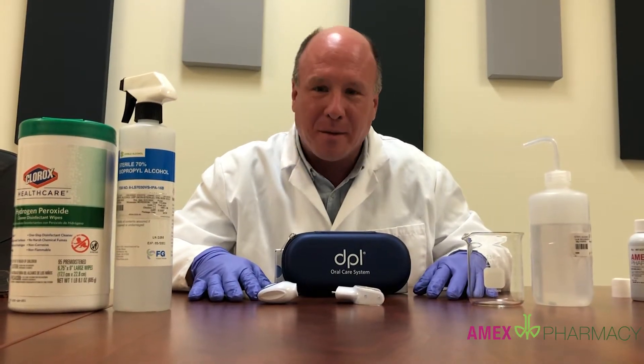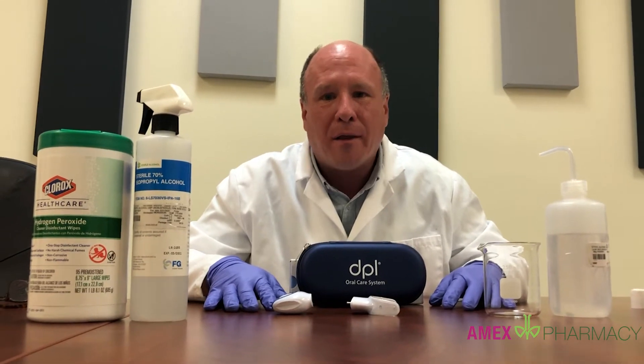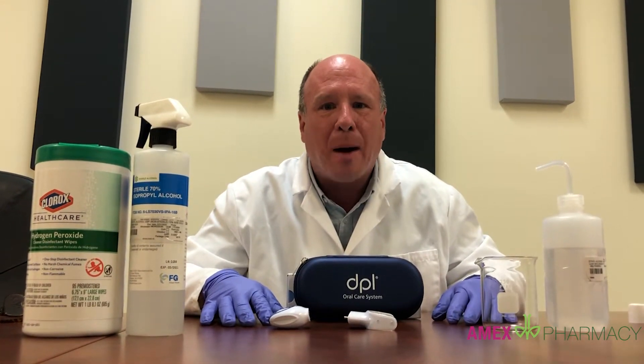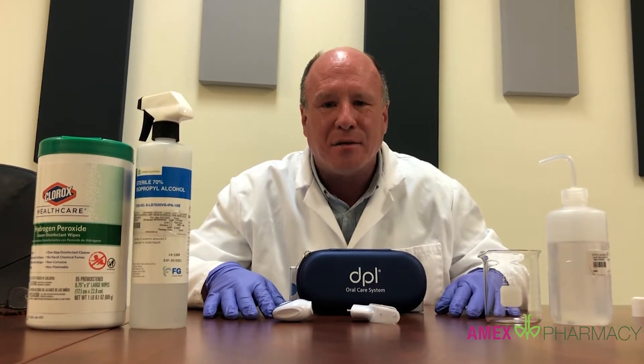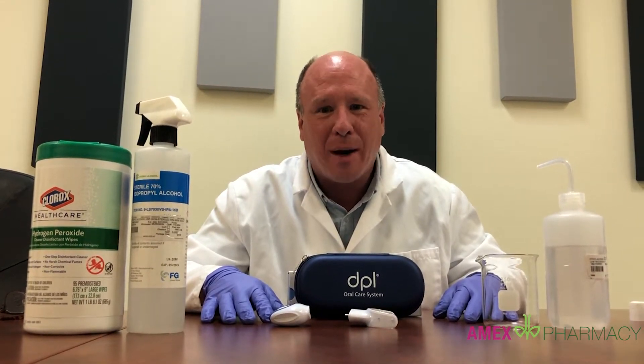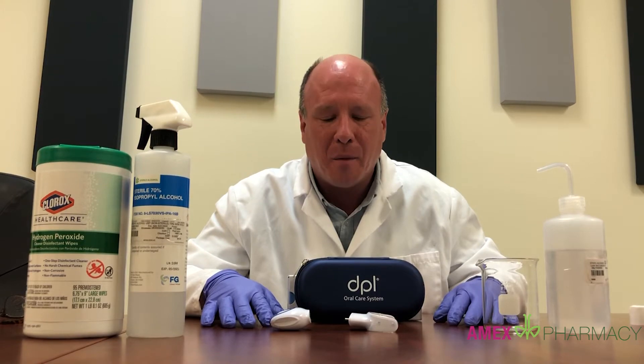Hi, Mike Boehmer with Amex Pharmacy and Nitro Medicine. One of the things we wanted to talk to you about today was the proper cleaning of the DPL Oral LED light device that your doctor has prescribed for photodynamic therapy.